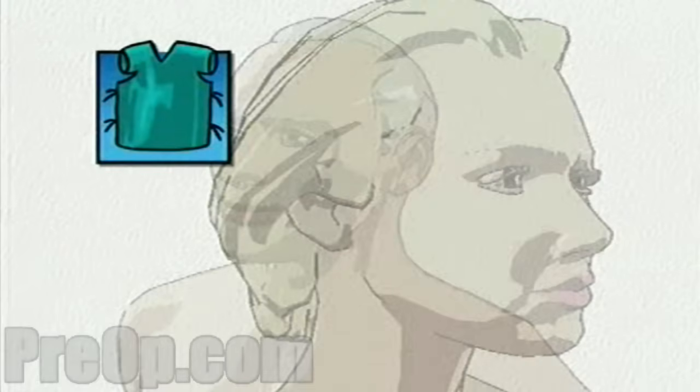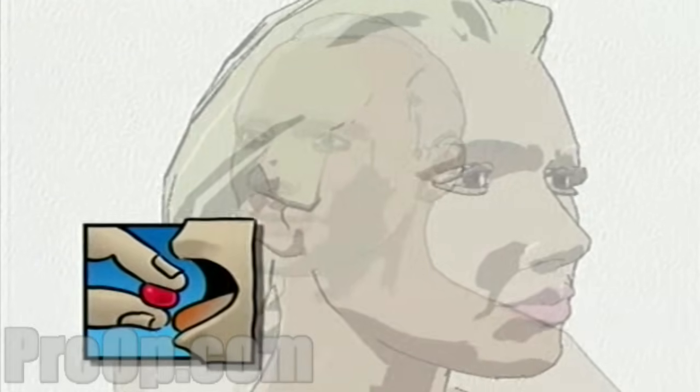On the day of your operation, you will be asked to put on a surgical gown. You may receive a sedative by mouth and an intravenous line may be put in. You will then be transferred to the operating table.